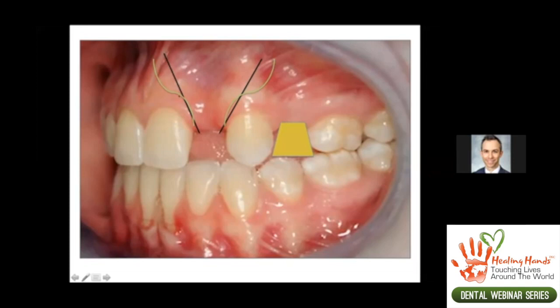You can extend this a little bit. I think I saw this type of design from Dr. Anthony Sklar's book, where he extends this incision further out. Again, very important to just not elevate the tissue that's supposed to be preserved here for the papilla aesthetics.